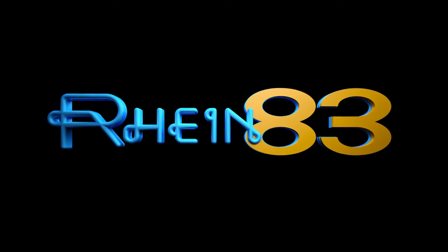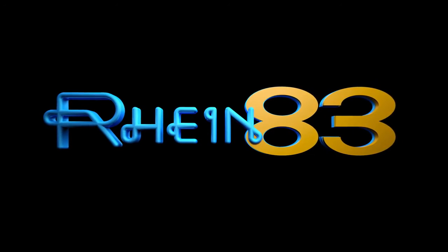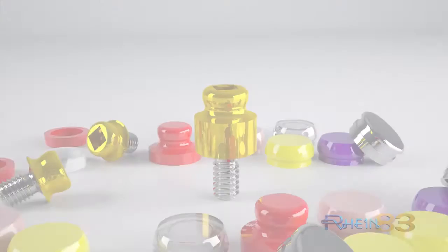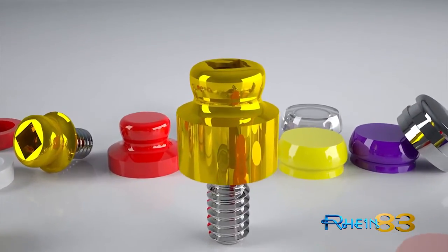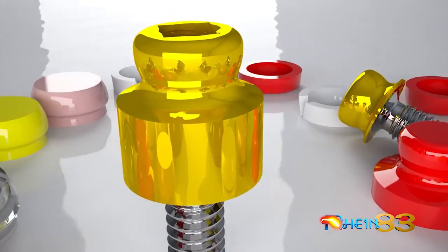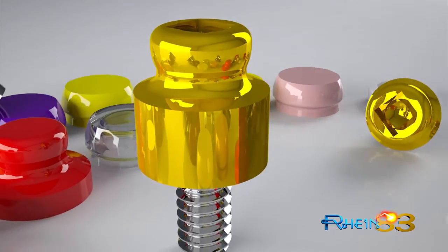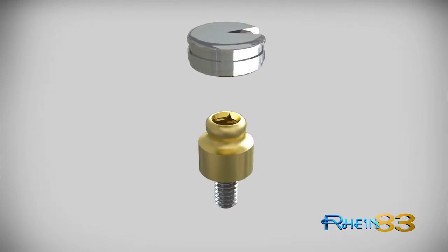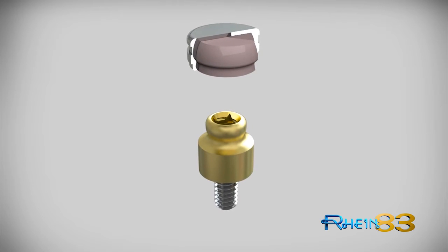Rhein 83, the leading manufacturer of dental attachments and implant abutments for over 30 years, is pleased to present the OT Equator, the new overdenture attachment featuring the lowest vertical profile. This new compact design with an internal thread will ensure multiple solutions for the most complex treatment plans, including those which demonstrate divergent implants. OT Equator's innovative design offers the best aesthetic results. OT Equator is the smallest attachment available on the market.